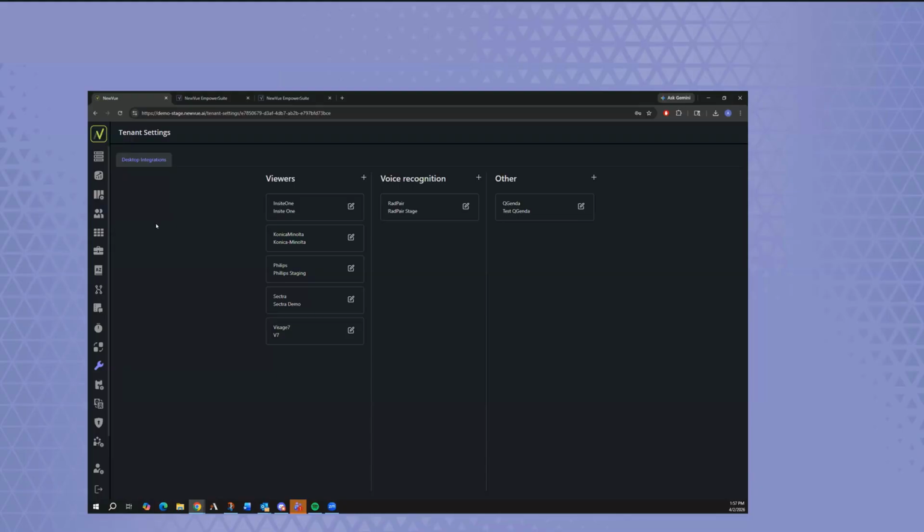You can launch those applications on the same desktop, as long as you're beholden to the restrictions from those. So two PowerScribes don't play nice in the sandbox. But generally speaking, with some of the newer applications or different vendors' products, there's no issue at all.